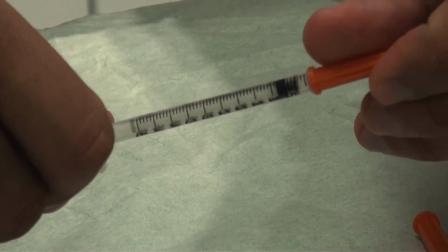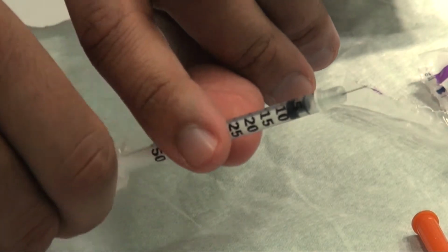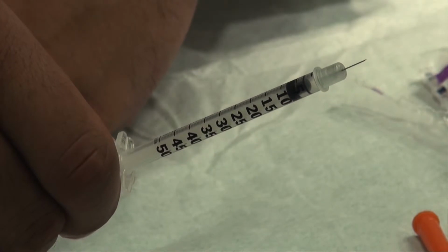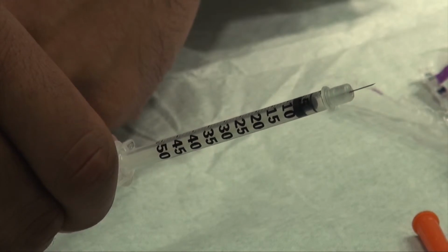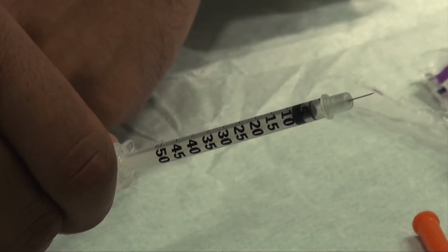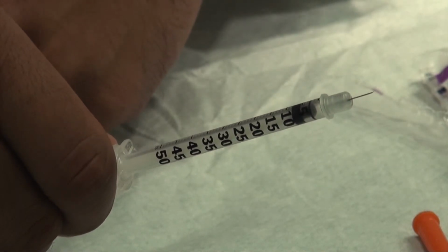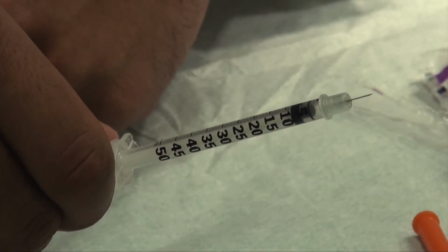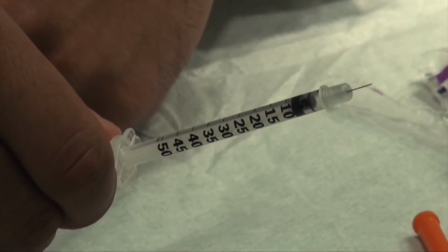Finally, let's show you the variant of the 0.5 ml syringe with the small needle. As you can see, this one has a short, stubby 8mm needle. Now, I find this useful when injecting, for example, around the eye in the crow's feet, because the limited length of the needle allows me to more precisely control and make sure I do not penetrate too deep in areas where the muscle lies quite superficial to the underside of the skin.